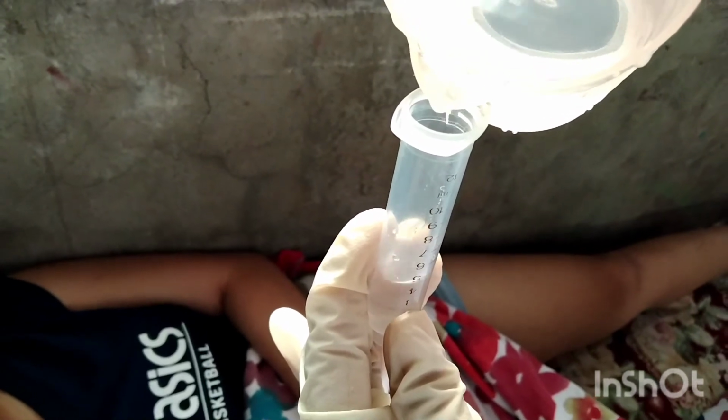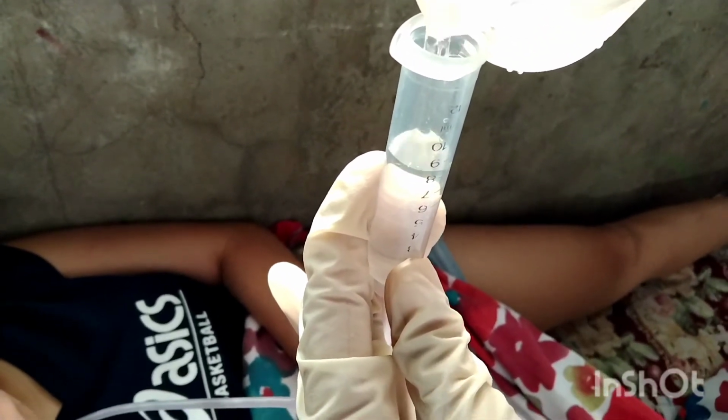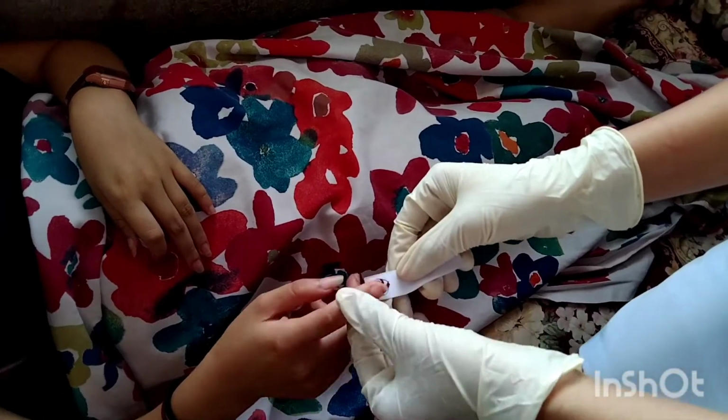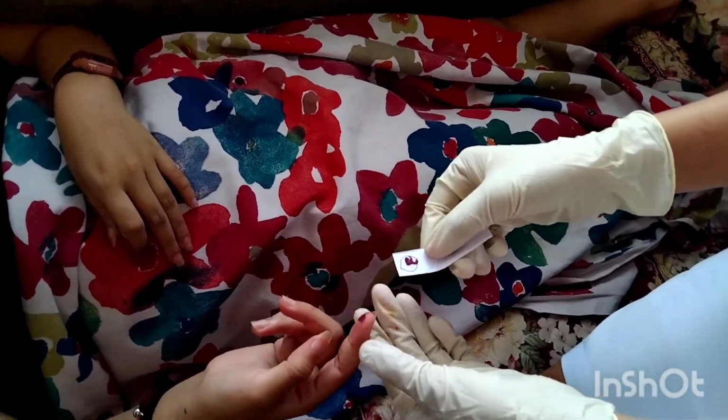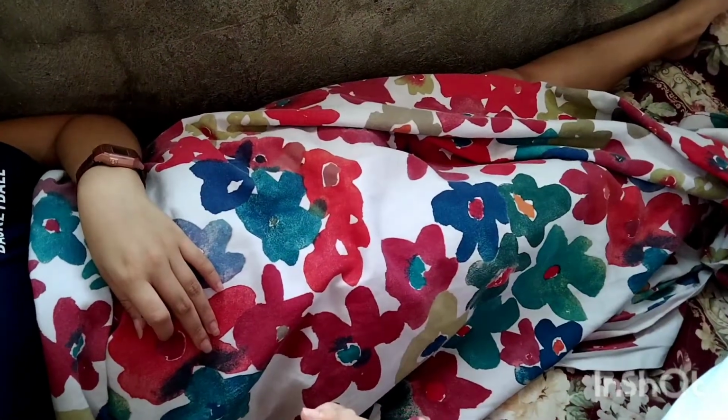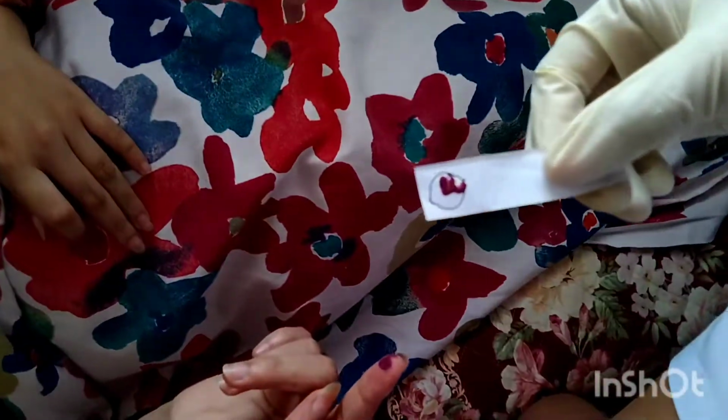Measure amount of aspirate residual every 4 hours. This evaluates tolerance of tube feeding. Next is to monitor finger stick blood glucose every 6 hours until maximum administration rate is reached and maintained for 24 hours. Alert nurse to client's tolerance of glucose.